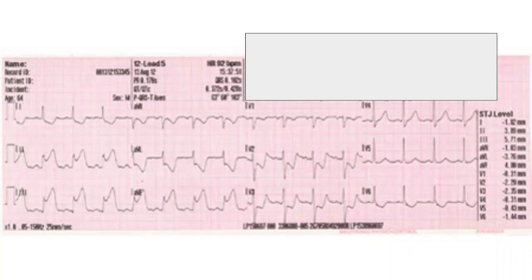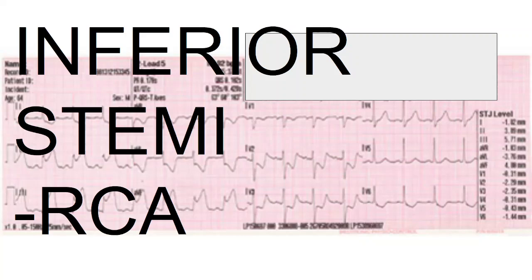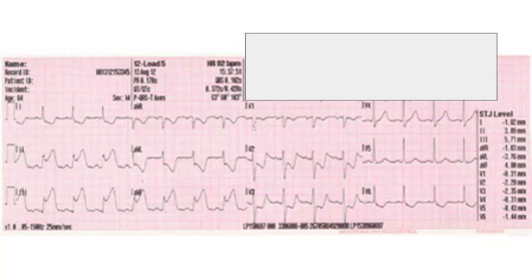This is an inferior STEMI — I gave you an easy one to start with. You can see in leads two, three, and AVF extreme ST segment elevation, and in leads one and AVL there is certainly reciprocal depression. Leads V2 and V3 show a significant amount of ST segment depression, indicating this patient is right coronary artery dominant and that the posterior wall of the myocardium is involved. This is a large area of infarct and a cause for concern for anybody working on this patient.